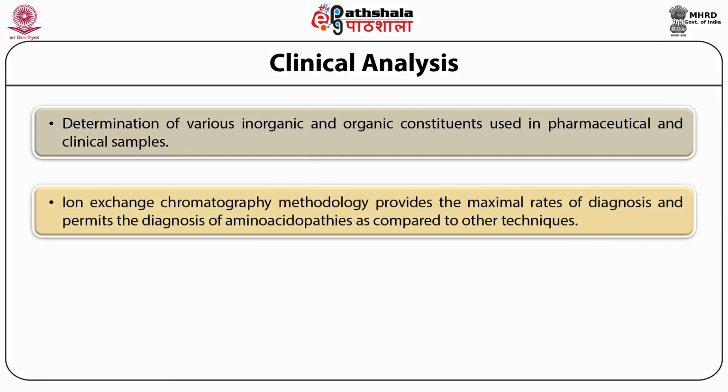It provides the maximal rates of diagnosis and permits the diagnosis of amino acidopathies as compared to other techniques, with thin layer chromatography declining to detect as the concentration of a few amino acids was very little.